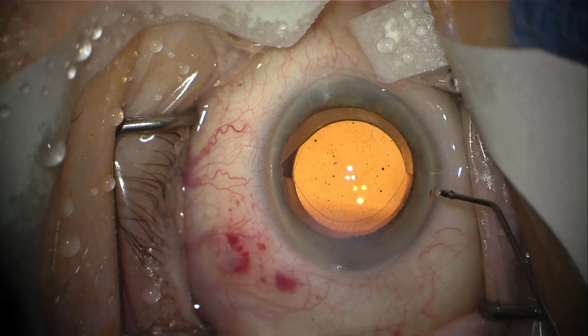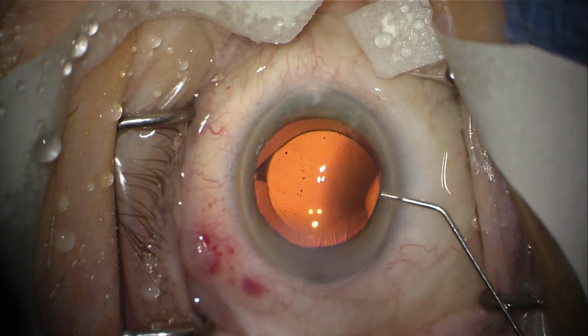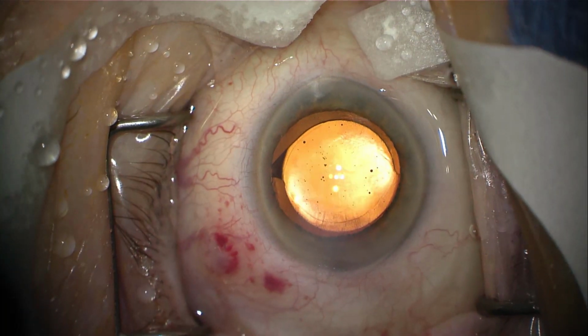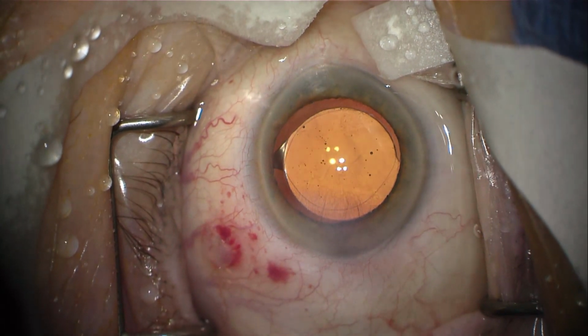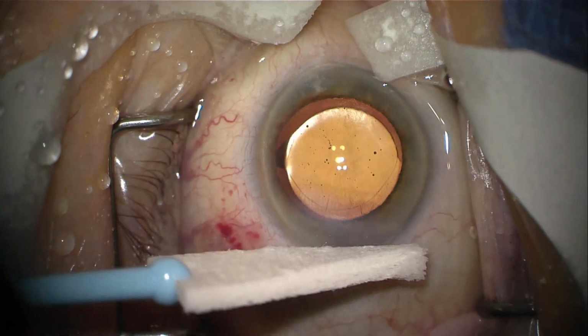And now I'm going to inject some additional solution. This is called Miochol. What this does is it shrinks the pupil a little bit. I have a very large pupil to do the surgery. It helps me to access the cataract easily. At the end of the surgery, I want to shrink the pupil a little bit. You can see the pupil is shrinking.